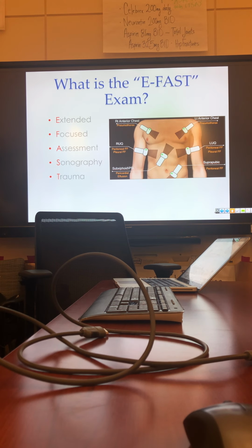Should we ask questions as you go along? Yeah, absolutely, if it's relevant to what you're talking about. So, I just took part of an exam, and the new thing that I was exposed to for the first time was ultrasound for pneumothorax. And I was like, where's the chest x-ray selection? And so is this replacing that? Is it heading in that direction?